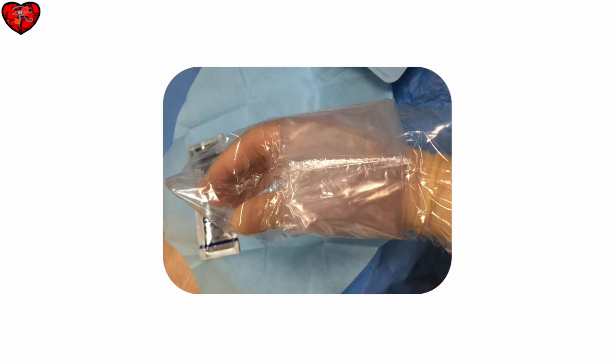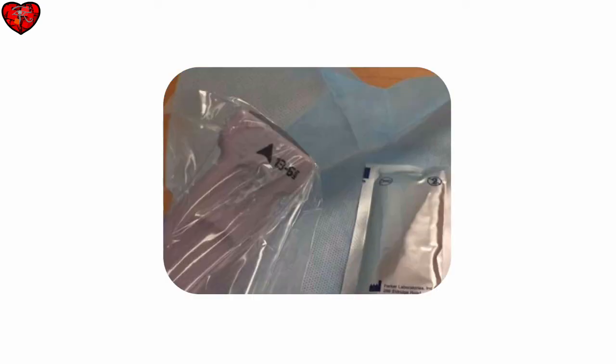Usually this probe cover is placed when you are sterile and have an assistant to help by holding the non-sterile probe while you place your hand in the cover like this, grasping the probe, and then this probe cover will slide down over the probe. Here you can see the closed end of the sterile sheath on the probe.